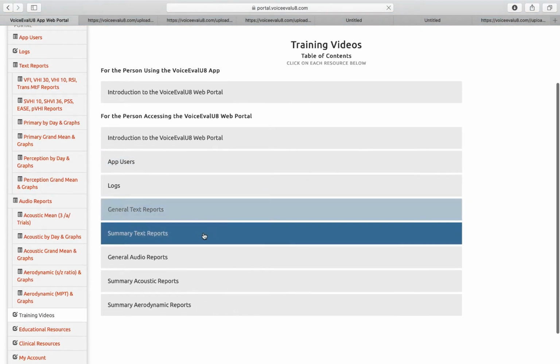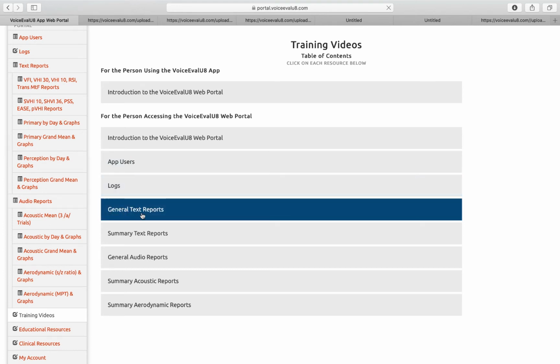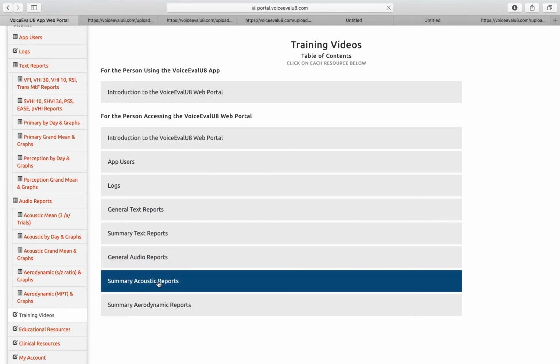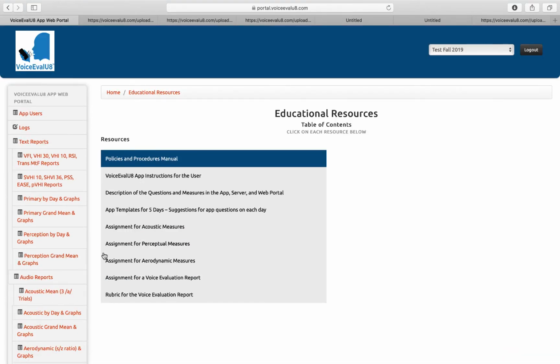So you can watch these videos to learn how to add or deny users, how to create logs, how to look at the generic text reports, how to look at all those summary text tabs that appear under the text reports. Same thing for audio. We have summary acoustic reports videos and a video for the aerodynamic reports. Then we get into educational resources.